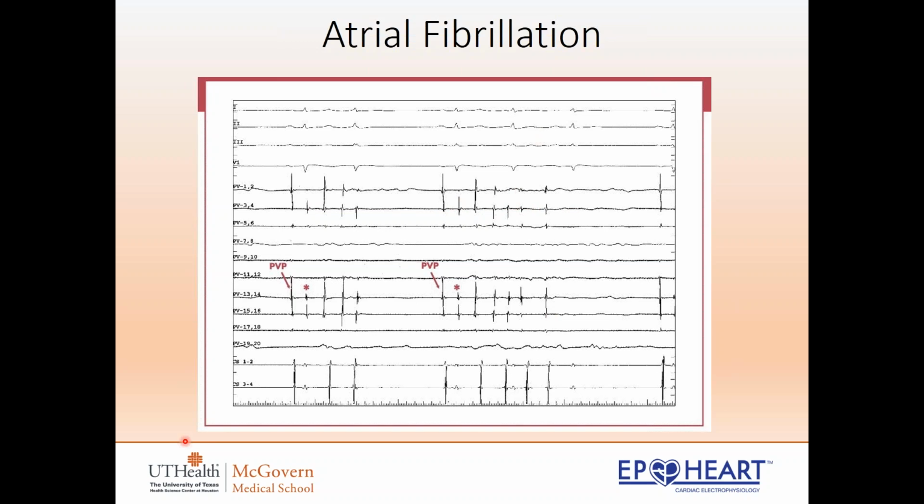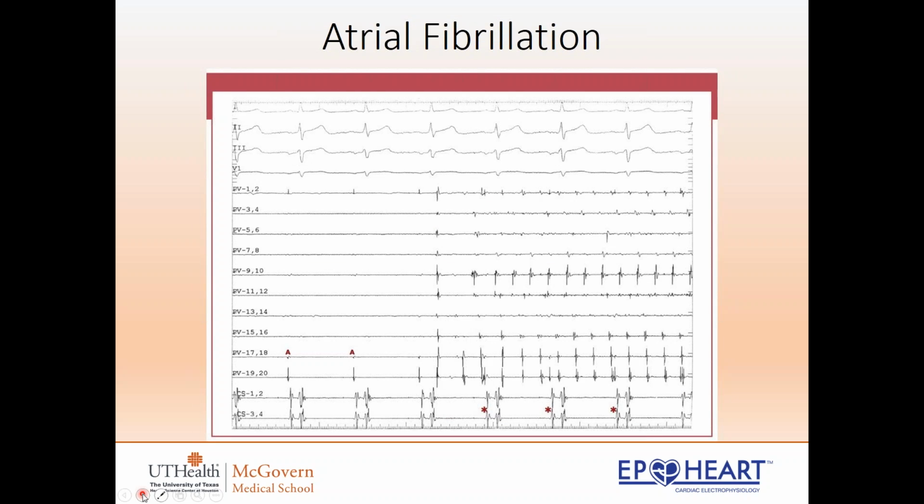So for an AFib ablation, we actually go in and we will isolate the pulmonary veins. So we burn around them. If you see here, in this case, we've burned around the veins and you've got normal sinus rhythm. This patient looks wonderful up here, normal sinus. But then if you look at this catheter that's sitting in the veins, it goes into AFib. So you see the erratic signals here, but they can't get out to the atrium because the atrium's still in normal sinus rhythm. So we've done our job. We've isolated this vein so it can fire all it wants, but it's not going to get out to the atrium, and that patient won't have AFib anymore.